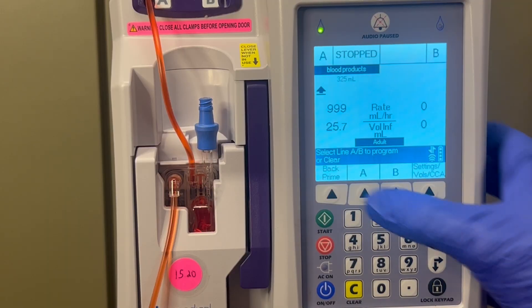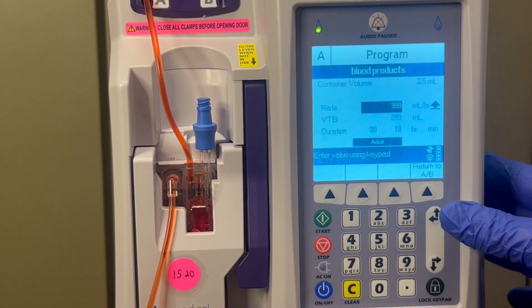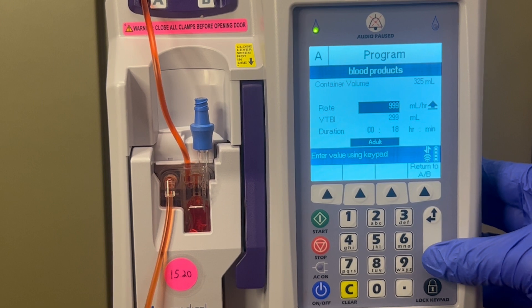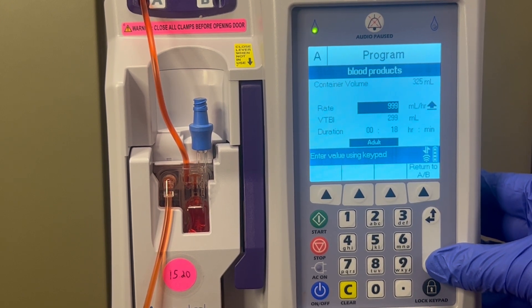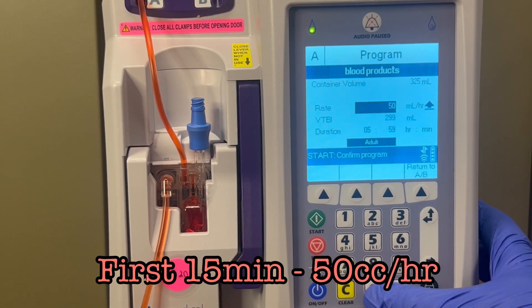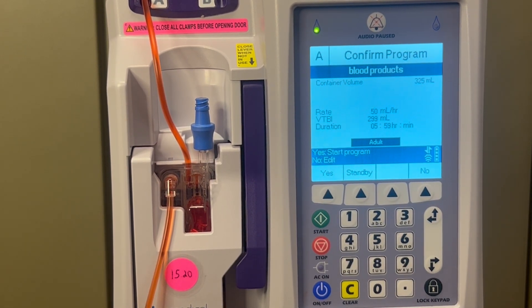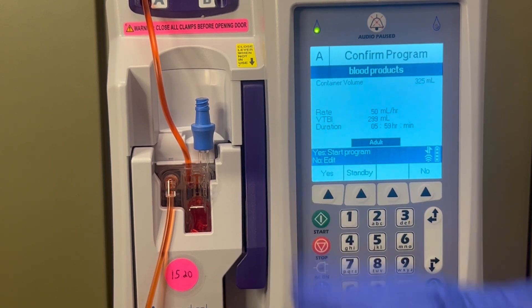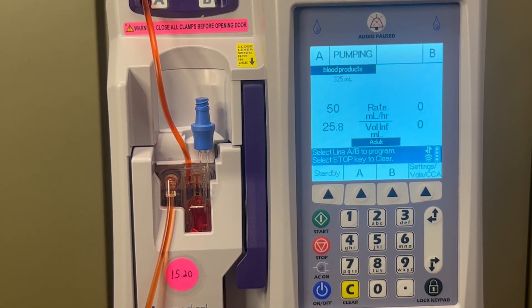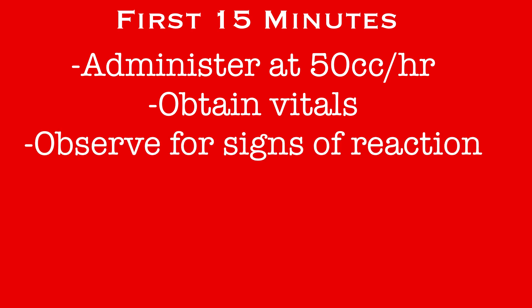Return to the pump to continue the program. Choose the A line again, and don't clear the settings that are already entered — we'll just edit them. For the first 15 minutes of any transfusion, the blood will be administered at the slow rate of 50 cc's per hour. So change the rate from 999 to 50 and push start. As soon as you start the blood, get a new set of vitals on the patient and document them in EPIC. During this initial 15 minutes, the nurse will remain in the room at the bedside, observing the patient for any signs of a reaction to the blood product.